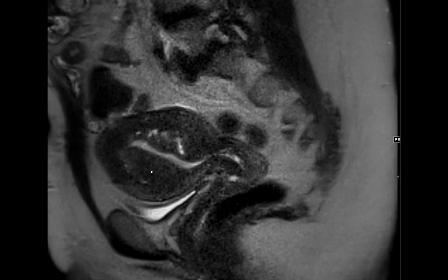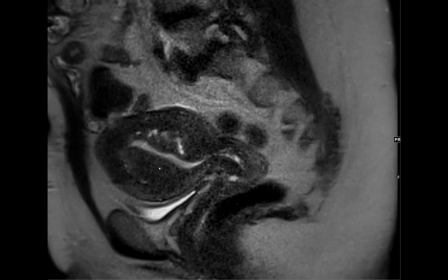And at SABI, Susan Asher recently gave a talk about adenomyosis. One thing I learned is that it's unreliable to use the junctional zone width in premenopausal patients. I had learned that you can use 12 millimeters, but they've now done an extensive study with path proof, and that's not reliable in premenopausal patients. In postmenopausal patients it is reliable, so you can still use 12 millimeters. In premenopausal patients, you have to look for cystic changes and irregularity of the border of the junctional zone. In this case the junctional zone is markedly thickened and there are all these cystic spaces, so it's clearer, but if it's just mildly thickened at 12 or more in a premenopausal patient, don't use that number.